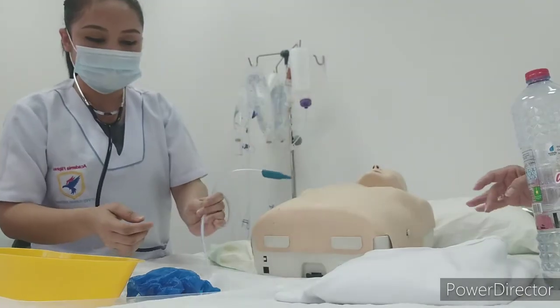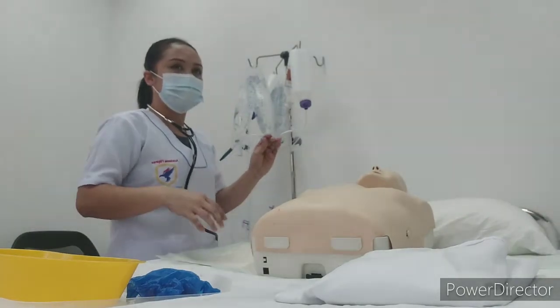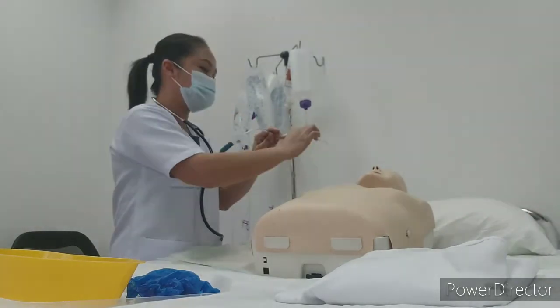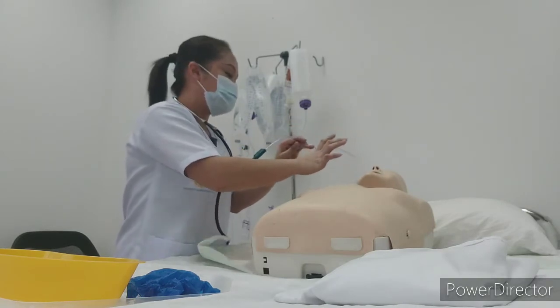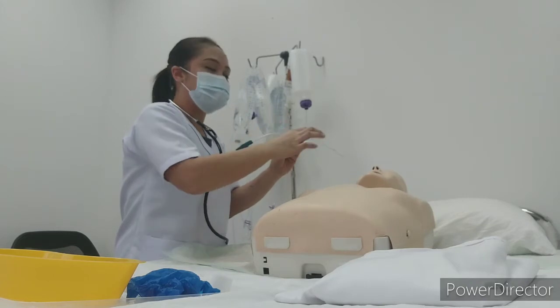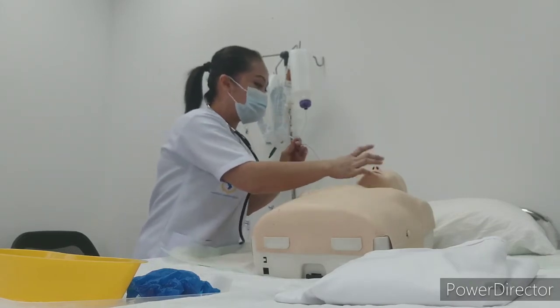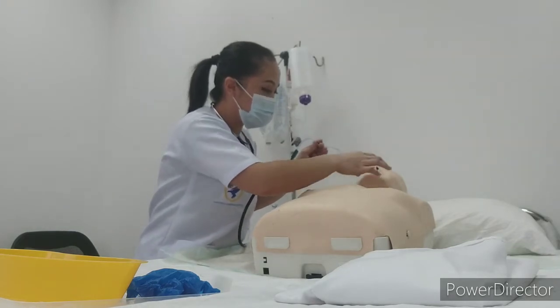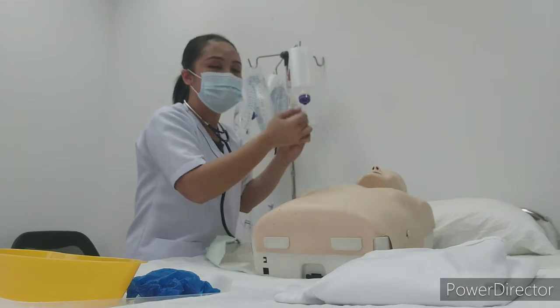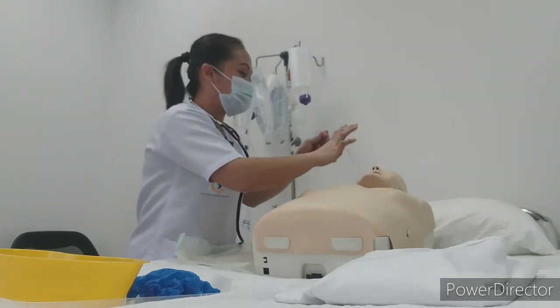Now we will tell the patient that we will start the procedure to put the tube inside the nose. Tell the patient to swallow until the tube will come inside the stomach. If it's already inside, check the mouth of the patient. If it is coiling, you need to redo it again. Do it again. Okay, so now it's okay.